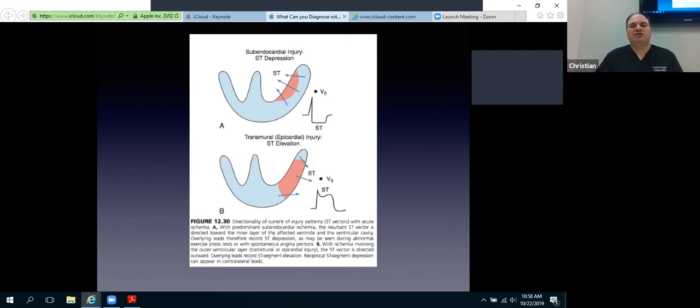That's a good reason. Serial EKGs, tabs on, and then you can come back quickly and do it. Yep, but those tabs fall off too because the tabs are cheap. So I don't know. But somebody out there may have figured something out, how to fix that.